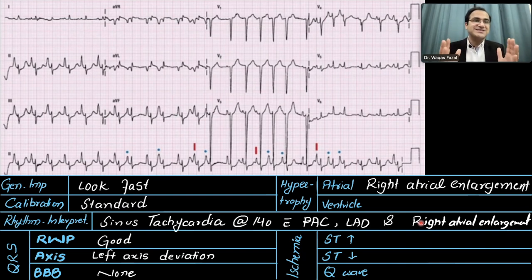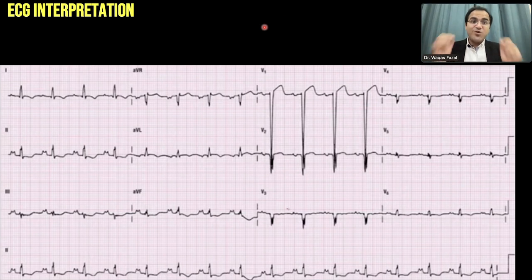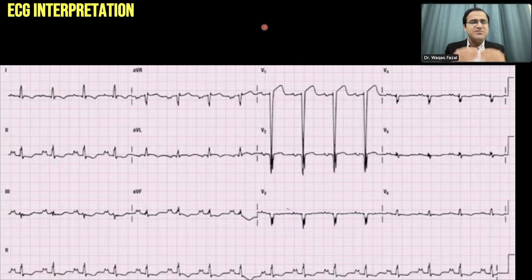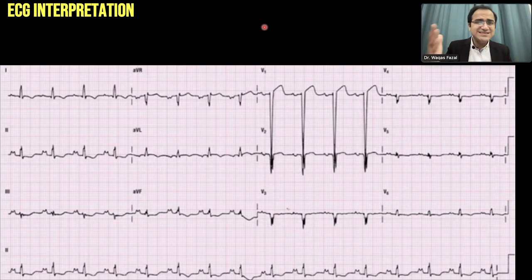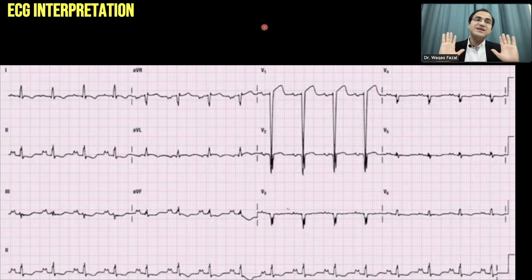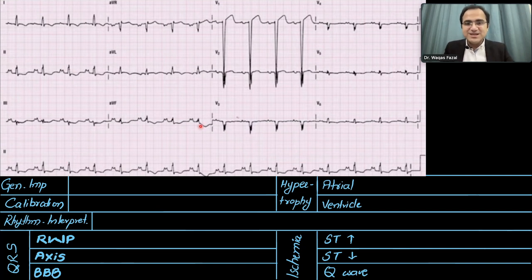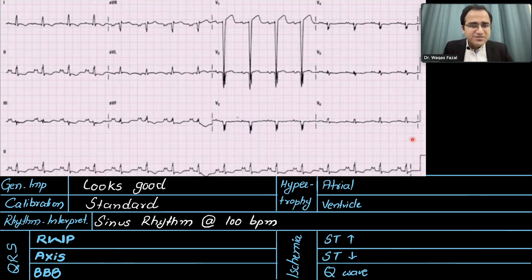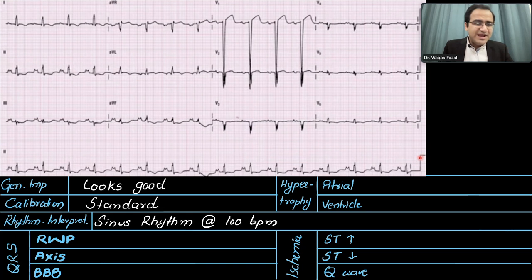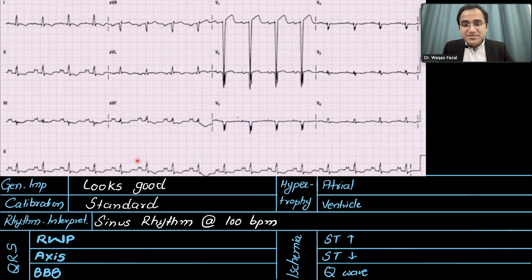You should pause the video and try to solve this ECG yourself — take a piece of paper and a pen and attempt it. Whenever you see any ECG, try to solve it using this six-step method and you will master ECG interpretation very easily. Now let's solve the next ECG. The general impression looks good — no ugly rhythms. For calibration, it appears standard at two large boxes tall.